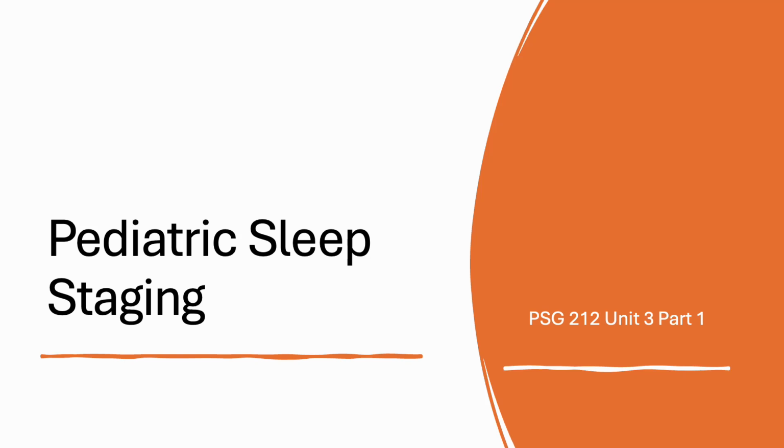All right, now we're getting into the dirt, the real stuff that you need to know about sleep technology. The rest is going to be on the exam probably, but not nearly as much as this stuff will be. And this stuff is actually what your job is going to be all about. All right, pediatric sleep staging.